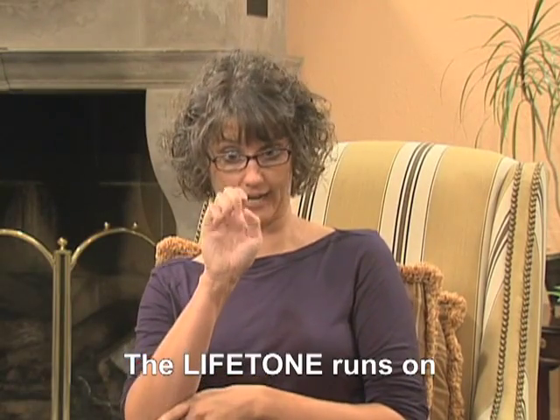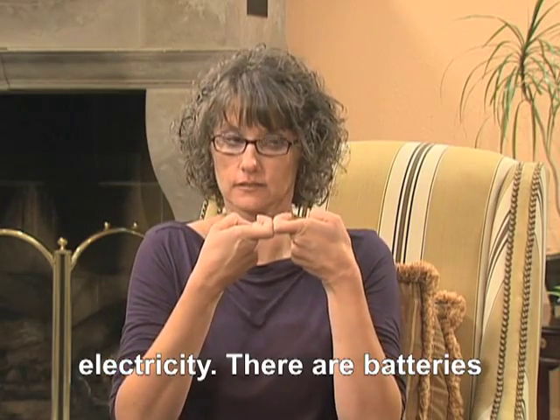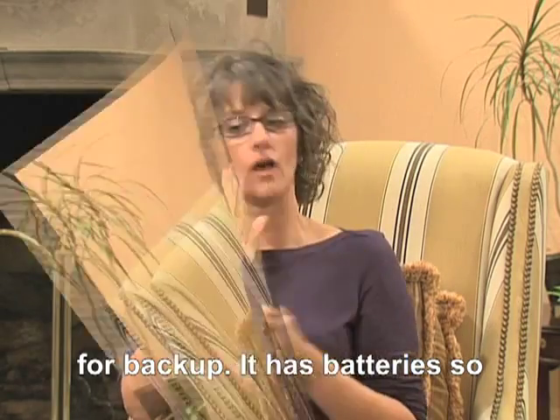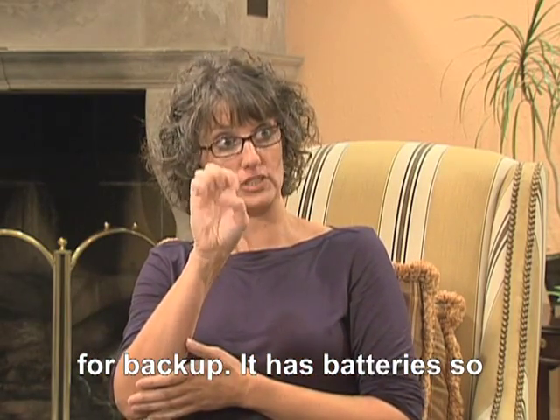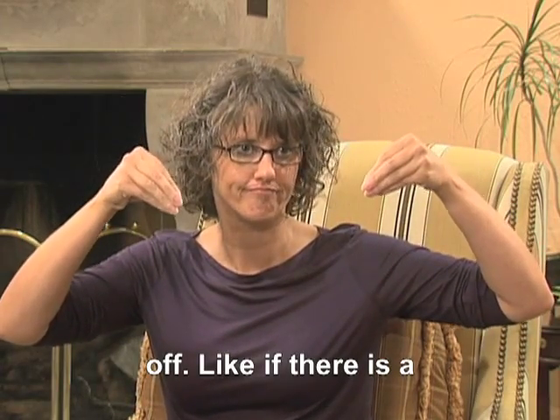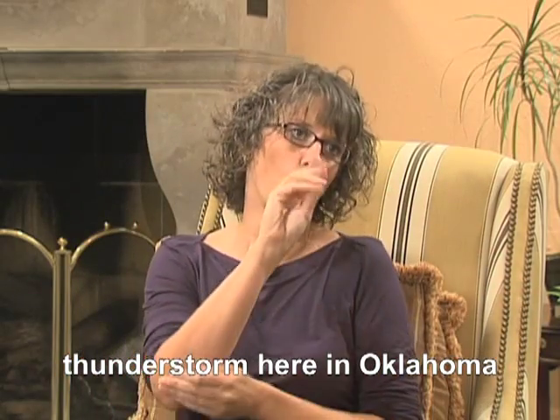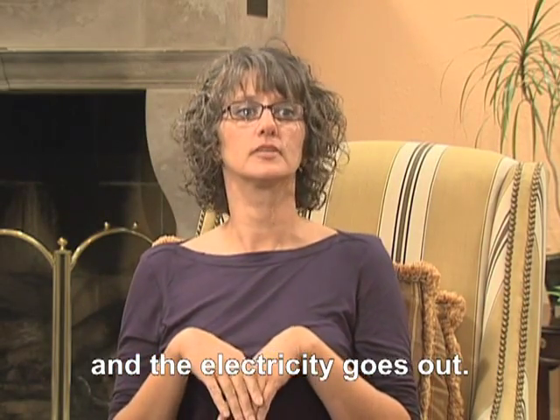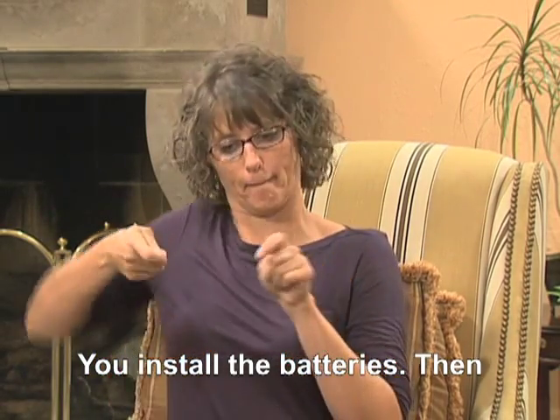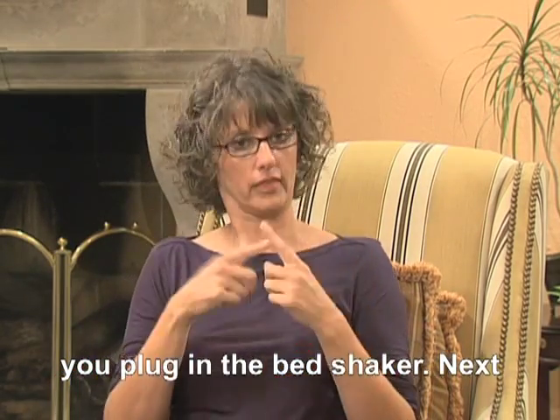The Lifetone runs on electricity. There are batteries for backup. It has batteries so it will work when the power is off — like if there is a thunderstorm in Oklahoma and the electricity goes out. You install the batteries, then after you put the batteries in, you plug in the bed shaker.